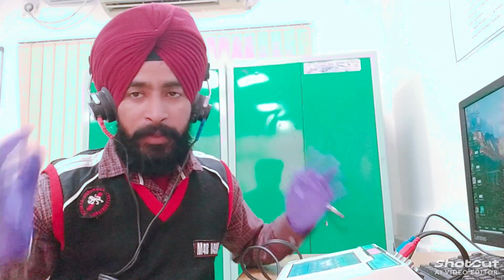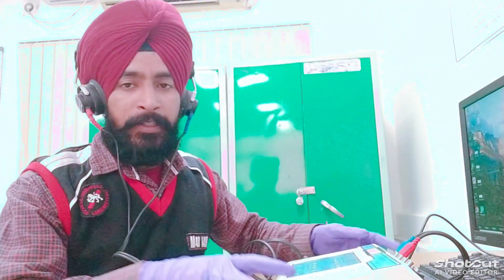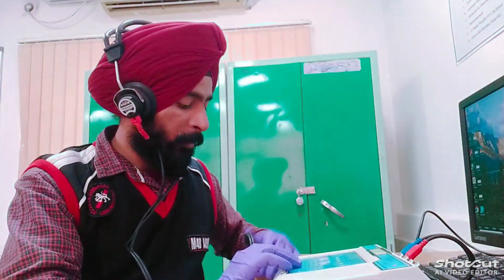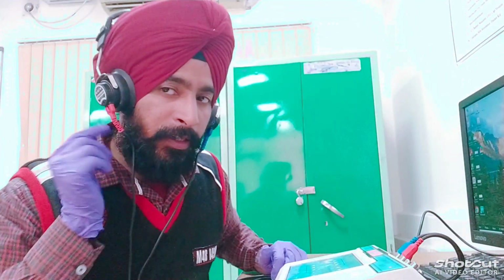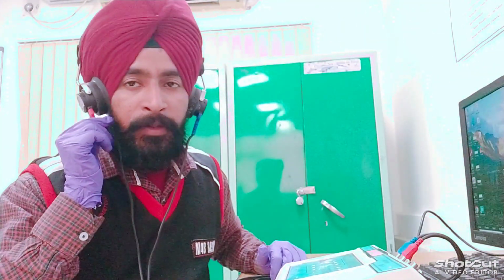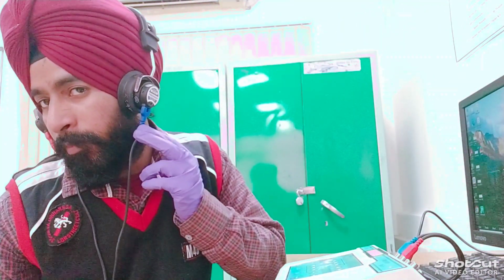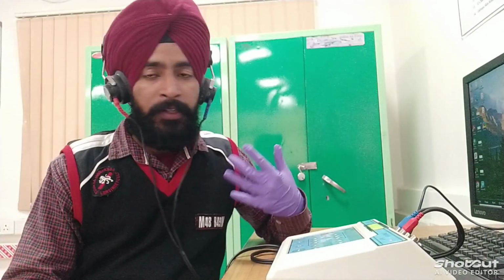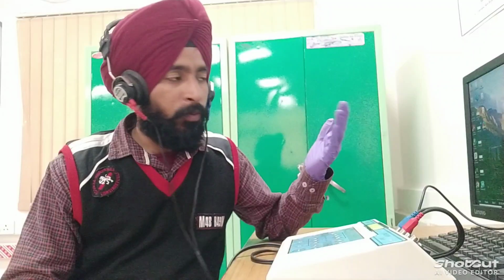Now you can see I am wearing the headset and connecting that headset to the audiometer. Here is the right-hand side which I use for the red one, and here is your blue connector which I use for the left ear. So now I move to the device and see what types of results are shown when I check my audiometry in this video.